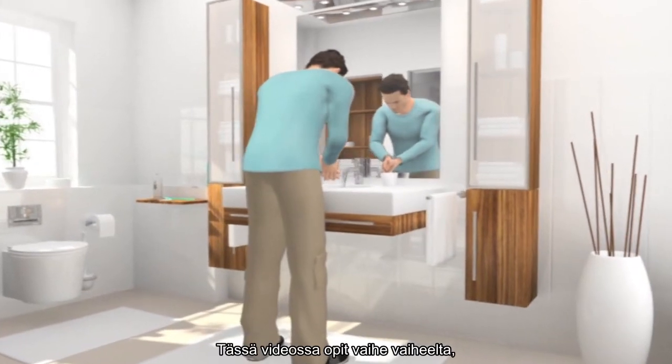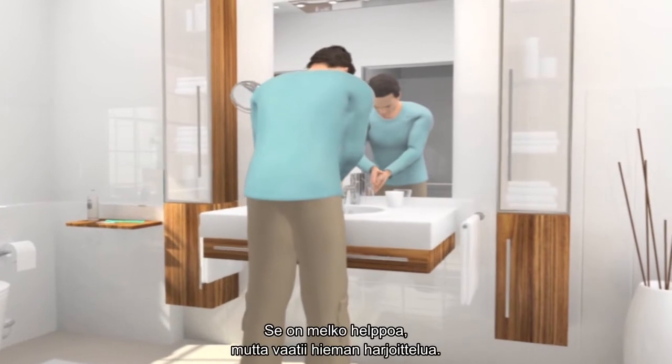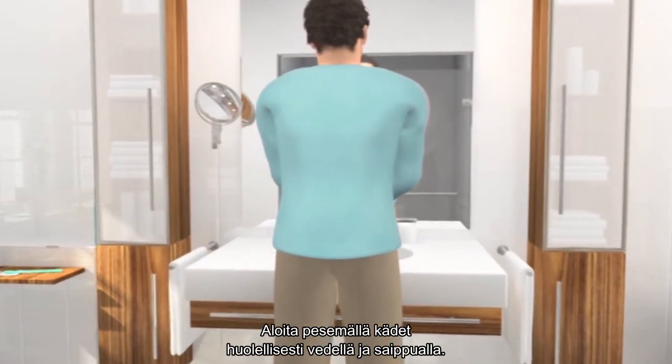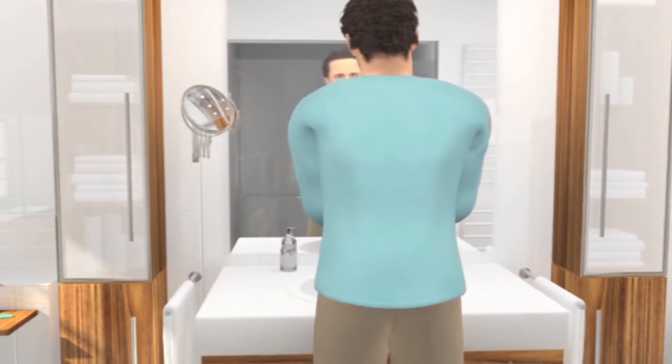In this film, you will learn, step by step, how to empty your bladder. It is relatively simple, but will require some practice. Start by washing your hands thoroughly with water and soap. Remember also to wash your thumbs.